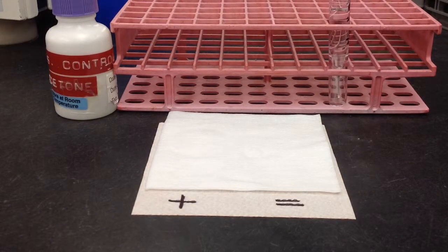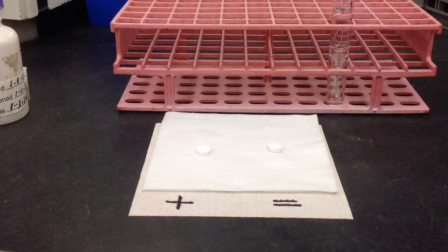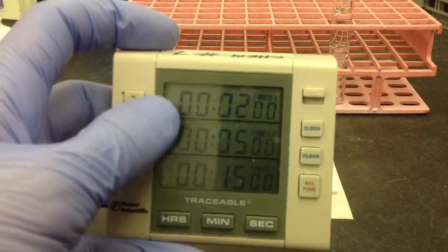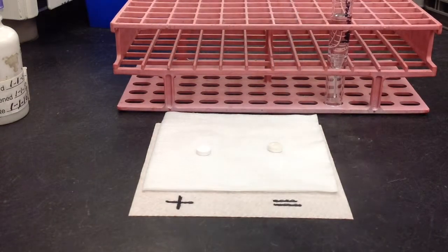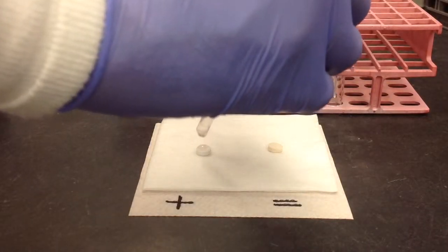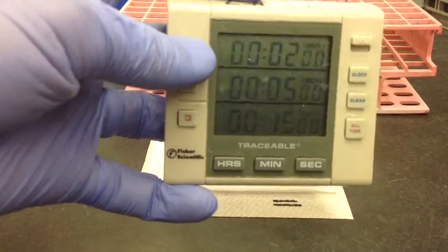The first thing you need to do for your ACE test is to go ahead and place the tablets. You're also going to need a timer set for two minutes. Once you have your tablets placed and your timer ready, go ahead and add one drop of the specimen to the tablet. Once you've added your drops to your corresponding tablets, go ahead and grab your timer and set it for two minutes.